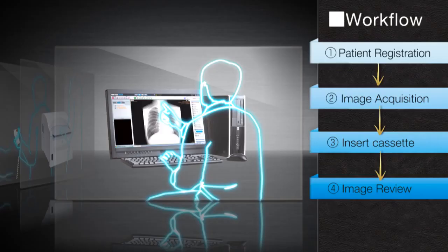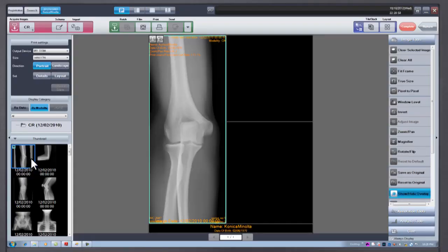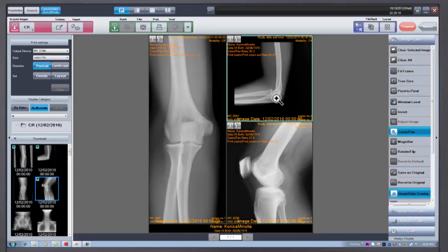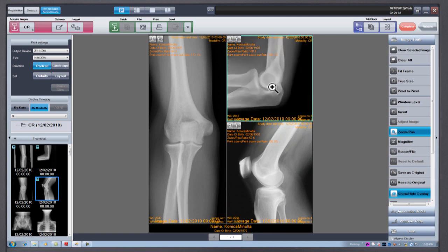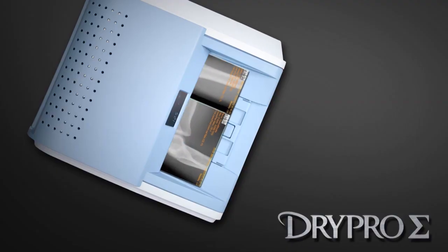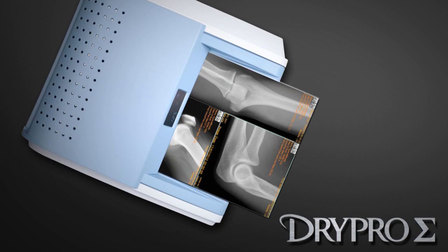The ImagePilot has a Print Composer mode where one can adjust images, layouts and annotations freely. Since adjustments can be made on the Print Composer layout screen, printing can be completed quicker and with more economical use of film.